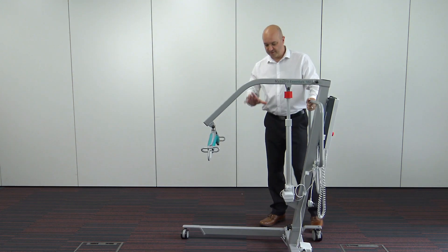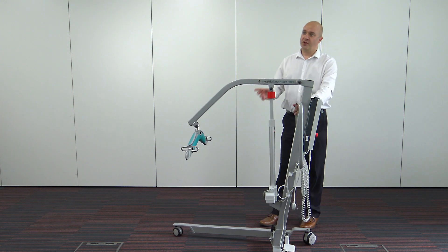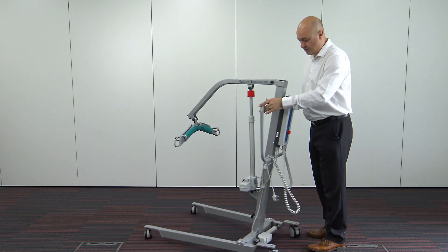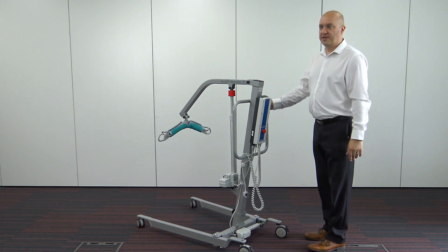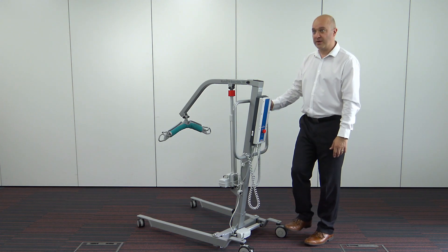On the hoist itself, starting from the base, we have 75mm casters at the front and 100mm casters at the back. The reason we put smaller casters on the front is because it makes it easier going underneath certain beds — if you have a bed with a centre bar, bigger casters can impede the hoist getting into position. The larger casters on the back make it easy to move over carpets. The brakes are also featured on the back casters, one on each side, which you can operate with your feet.